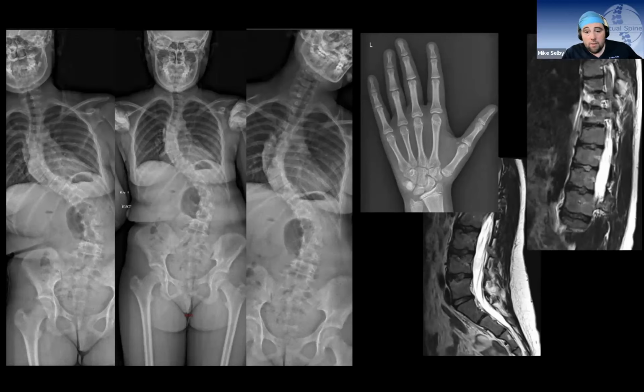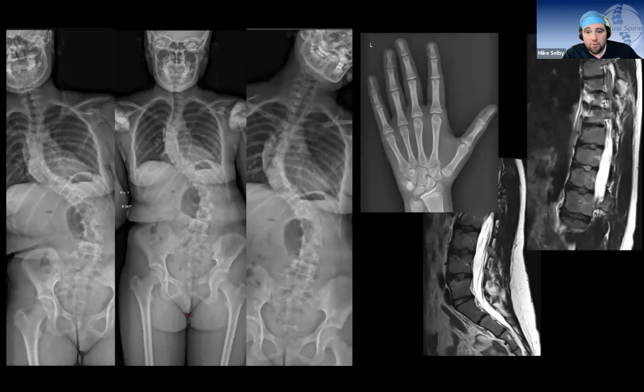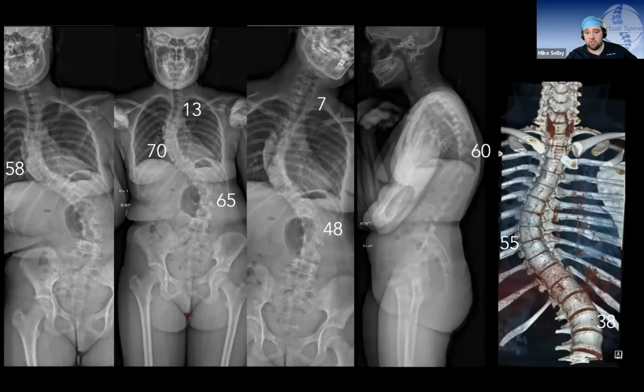So, those disc changes at the base of the spine, if I go forward a bit as well, they're kind of present up in the thoracic as well. I don't think this is normal idiopathic scoliosis. It's actually an unfortunate, really rare combination of Scheuermann's with a different apex of the kyphosis in the thoracic spine to the scoliotic curves, which makes it incredibly challenging.